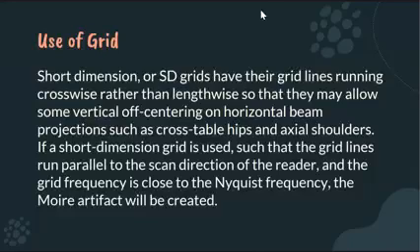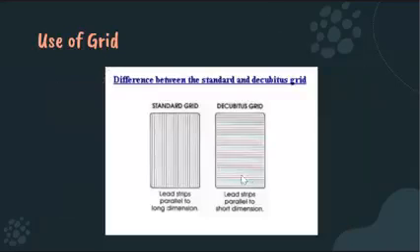Okay, so to give you an idea of what an SD grid looks like, ito po siya. Normally, the standard grid runs lengthwise, no? Pataas, pahaba ang kanyang pag-run ng lead strips. Okay? So, always remember that your grid is composed of both lead strips and interspace material. Okay? So, the lead strips are the ones that absorb radiation, and through the interspace material pass the parts of the primary beam towards the image receptor.